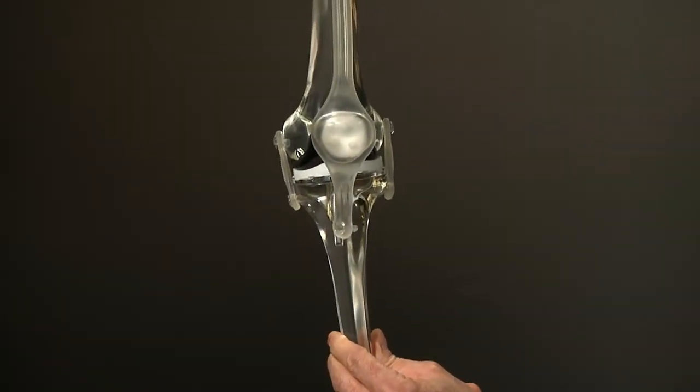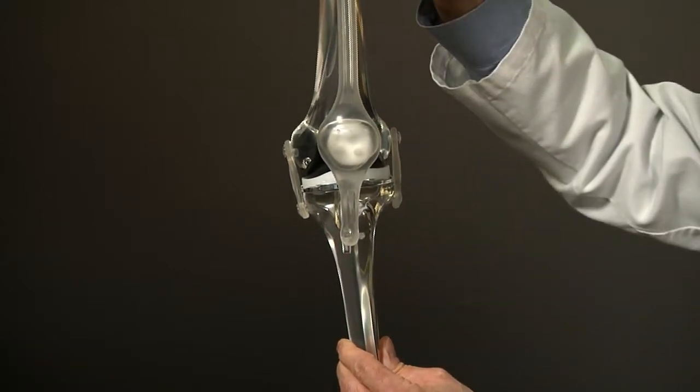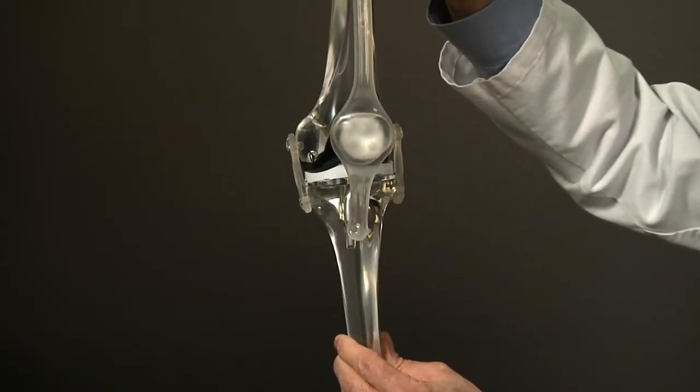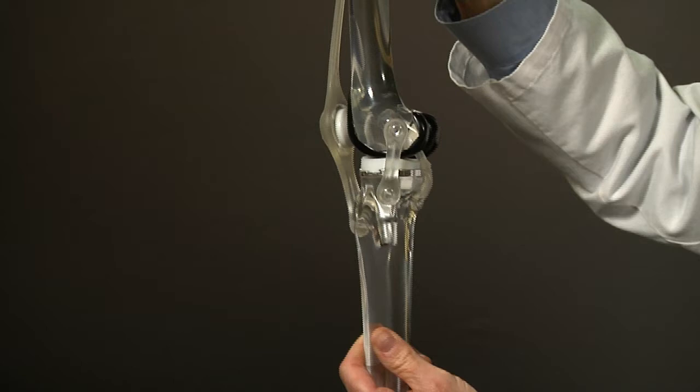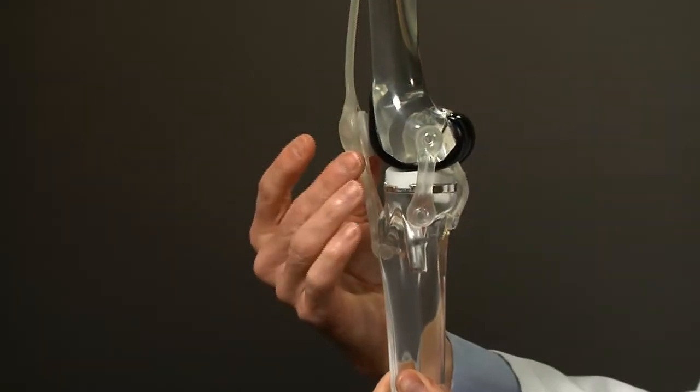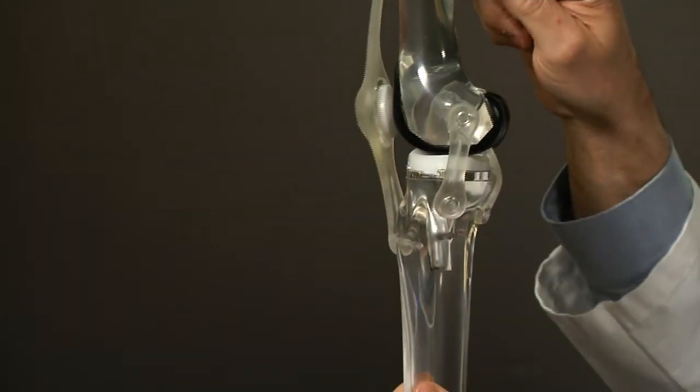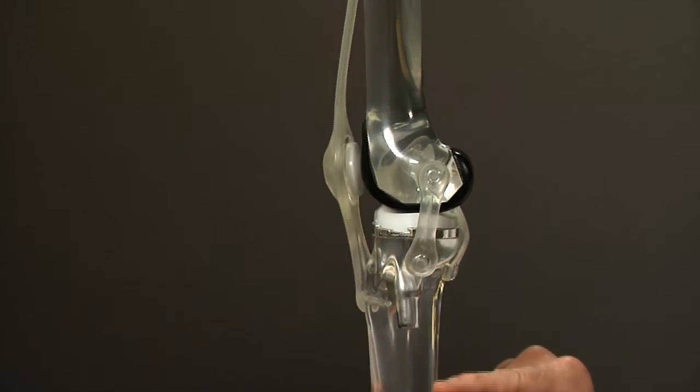This is a model of a completed total knee replacement. We're looking from the front, and now we're looking at the side view: the kneecap in the front, the thigh bone above, the shin bone below.